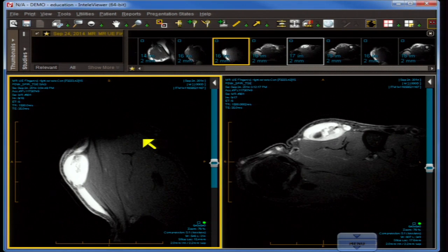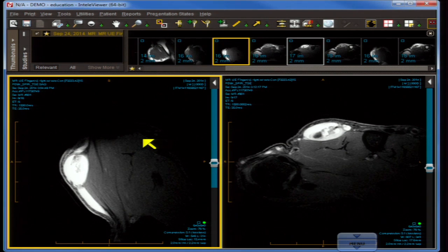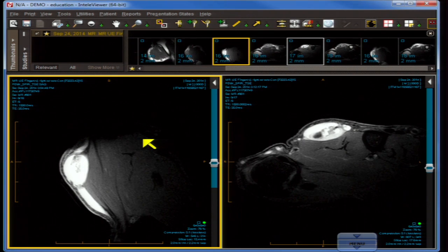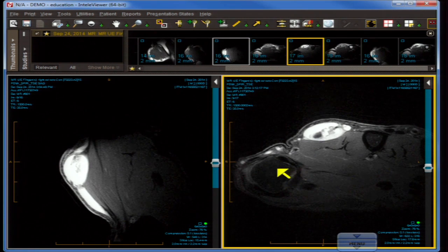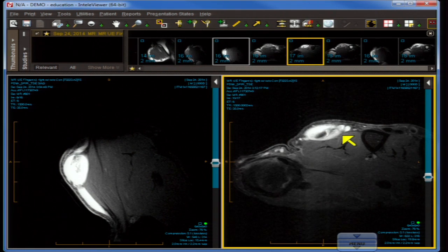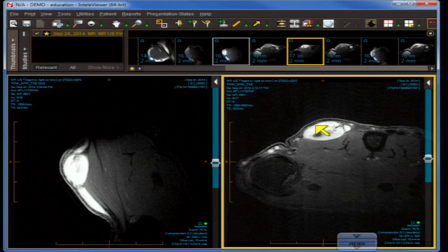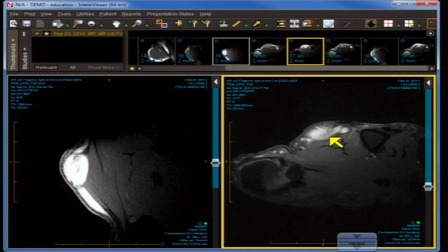This is a middle-aged male who presents with a mass in the first web space — between the first and second digit — that is getting slightly larger and is a little bit fluctuant. In the short axis projection using a fat suppression sequence, which you can tell from the very black appearance of the fat, there is a mass exactly where it was suspected. The mass is mostly hyperintense but in the center is an area of hypointensity, making it somewhat heterogeneous.